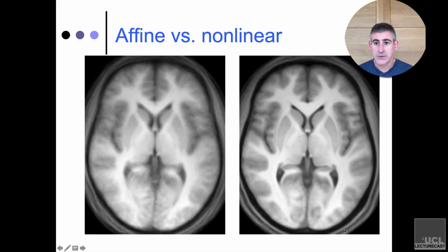But the summary of what I'm trying to say is that there's real variability here, and trying to get rid of that variability is an inaccurate representation of one of the things that's interesting across brains. So it's better to look at this affine and blurrier brain because that shows you something about the underlying variability in the anatomy, which is important. It's not something that's due to head motion or anything else that's unrelated to what we're interested in, right? The anatomy is what we're interested in when we're looking at functional anatomy. So trying to get rid of the inconvenience of the fact that people's heads are different seems like the wrong way to go, in my opinion. Bear in mind, definitely a minority opinion.